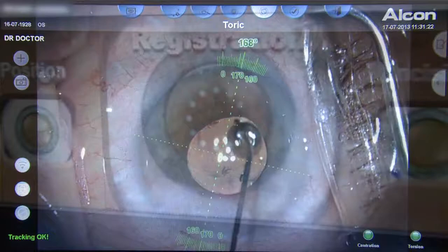See what the Varyon Image Guided System can do for you. It might just change the way you perform cataract surgery.